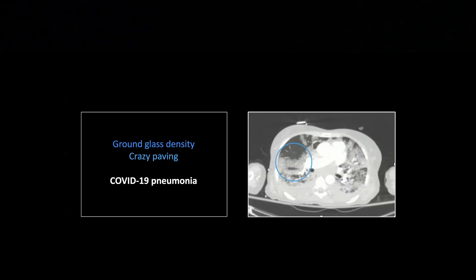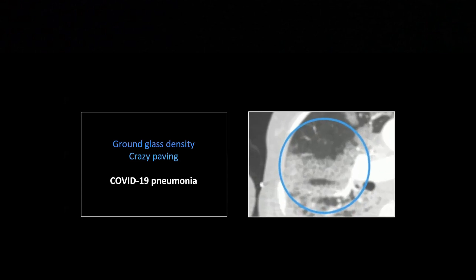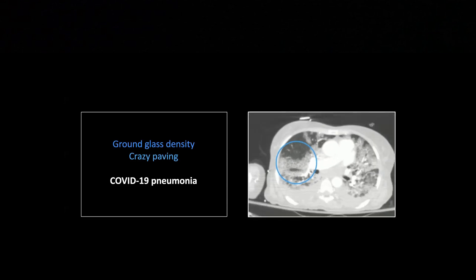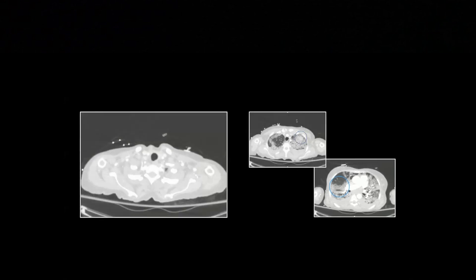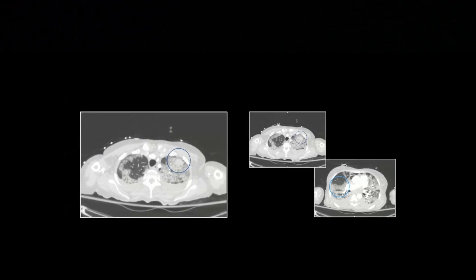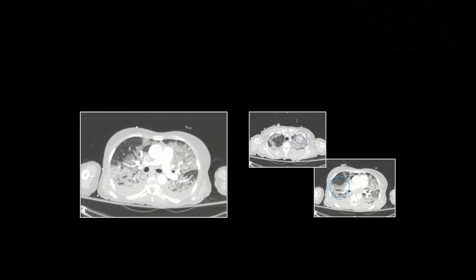Now here is about the most extreme example of crazy paving that I could find. You see how it starts to look, it looks almost like chain mail, with little squarish circles all connected together there. That again is interlobular septal thickening. If you look up the differentials on both ground glass and crazy paving, you'll get pages and pages of stuff that could potentially do this. But certainly COVID is something that should come to mind in this day and age.